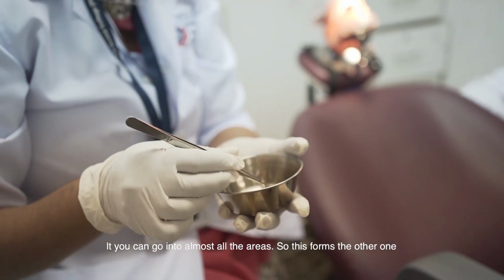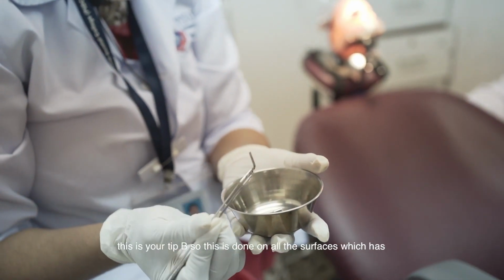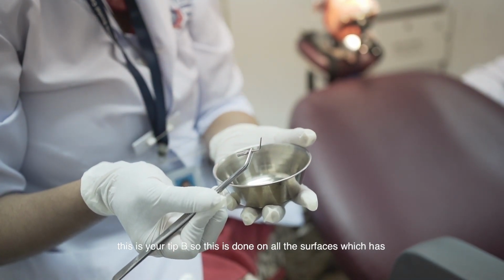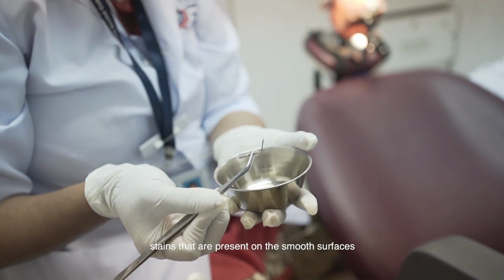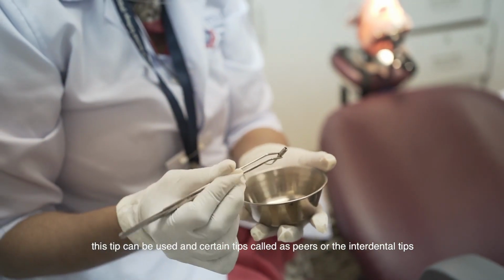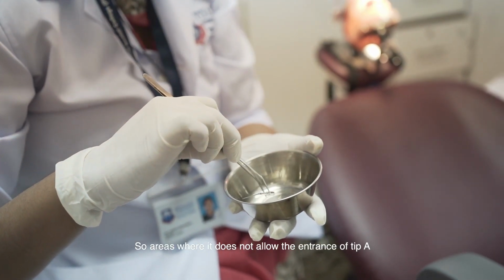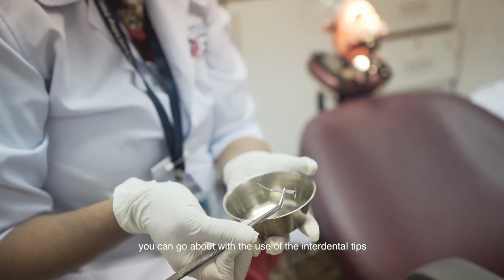The other one is your smooth surface scaler, which is your tip B. This is used on all the surfaces where stains are present on the smooth surfaces. Then there are certain tips called the PS or the interdental tips. For areas where tip A does not allow entrance, you can go about with the use of the PS or the interdental tips.